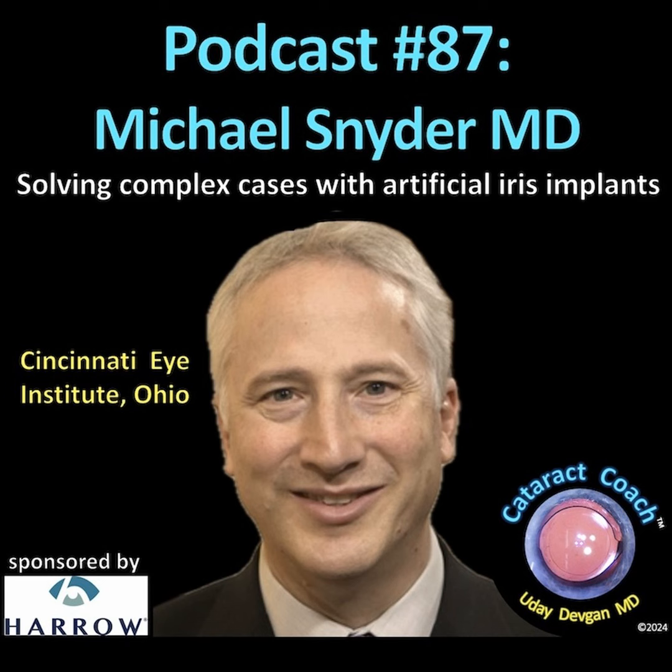But what I do know is that if somebody comes in to see me after I did cataract surgery on them 5-10 years ago, and now they've got a subluxated implant lens capsular bag complex with a capsular tension ring in it, well, that's pretty easy to fix. Because the CTR's in there. You can wrap a couple sutures around it. I usually will just put in 3 loop sutures around the ring in a tripod, and that case is going to be fine forever. If, on the other hand, I didn't put a ring in and the capsular bag complex is loose, oftentimes these patients will also have a dead bag, and then it's going to become a vitrectomy sutured PCIOL case, which is bigger incision, more work, a little more OR time.